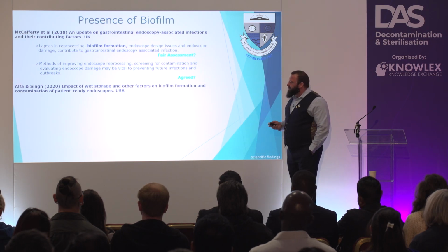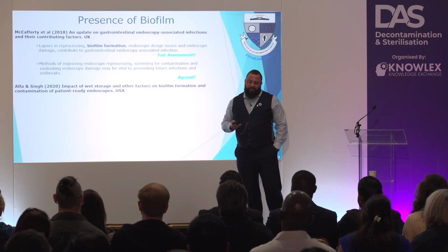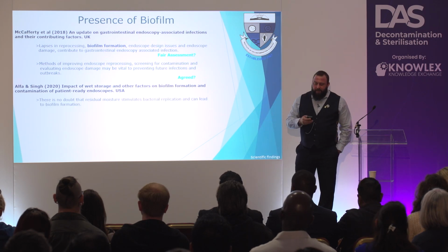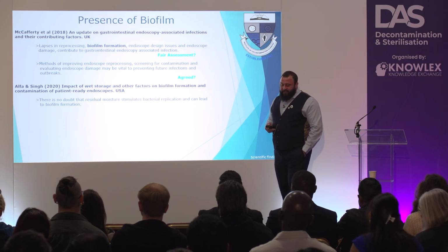Alfa and Singh. Michelle Alfa's done a lot of work over the last couple of years looking at various issues with endoscope decontamination, but this study was for the impact of wet storage factors. They found that there is no doubt that residual moisture stimulates bacterial replication and can lead to biofilm formation.